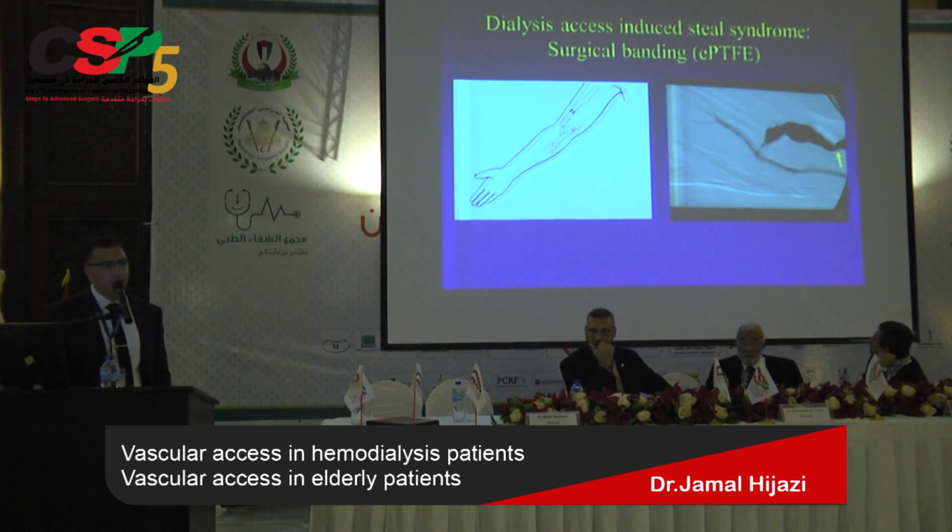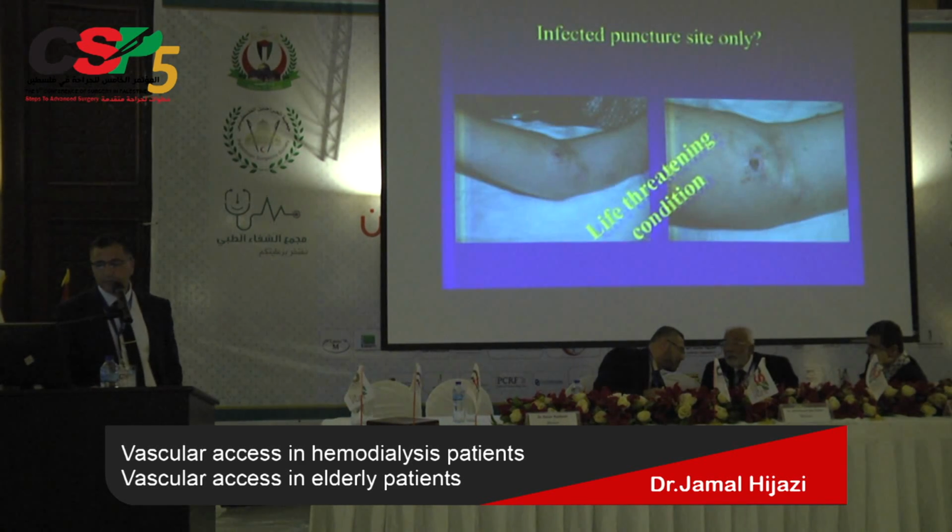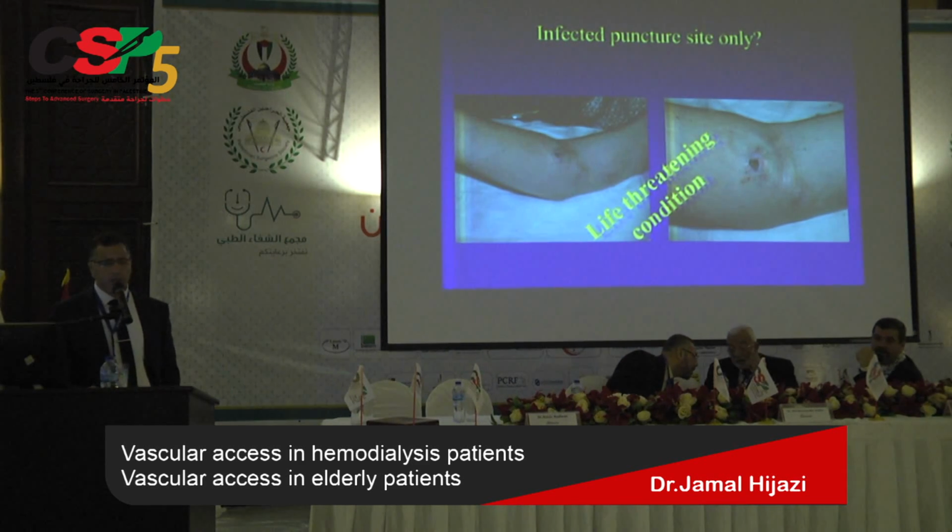Sometimes if there's a necrotic wound and we are afraid that the patient may need amputation, if we can wait, we close the fistula. Here's the hand after the banding of the fistula. Another life-threatening condition is an infected puncture site.